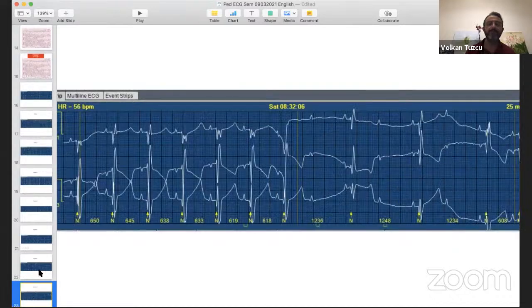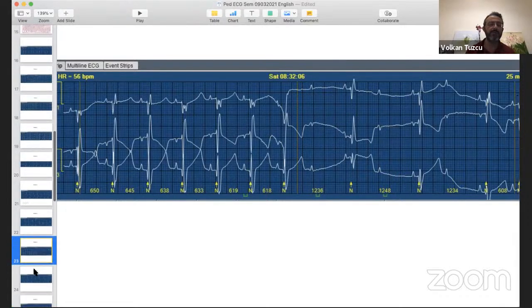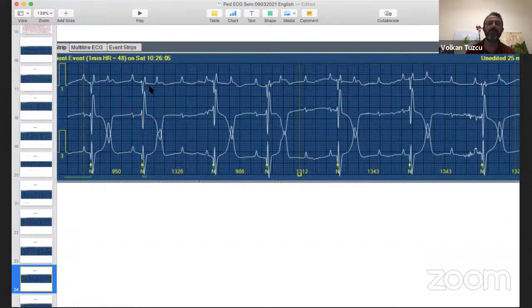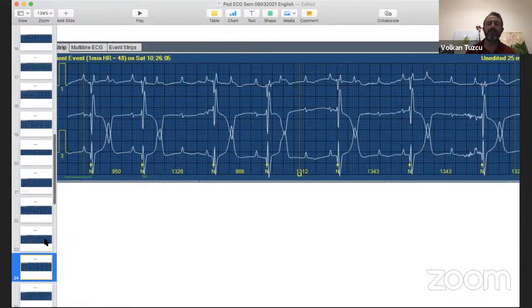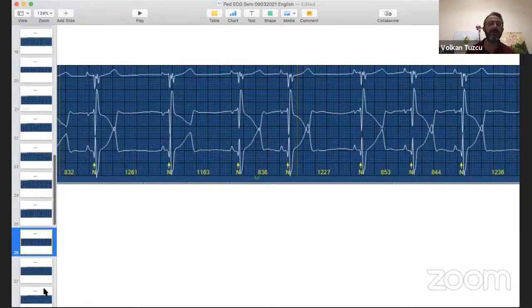All right. So same patient, different areas. You see it's normal conduction, and suddenly you have a blocked PAC, and the patient goes into 2-to-1 AV block, like one conducted, one not, before it's conducting normally. So this is a patient with 2-to-1 AV block. Again, different areas, same P waves, PP interval stable. Therefore, this is not a PAC, right? And here it's more block, 3-to-1. So this patient is trying to do complete block, right? Again, 2-to-1 goes to 1-to-1, so it switches between different ones.